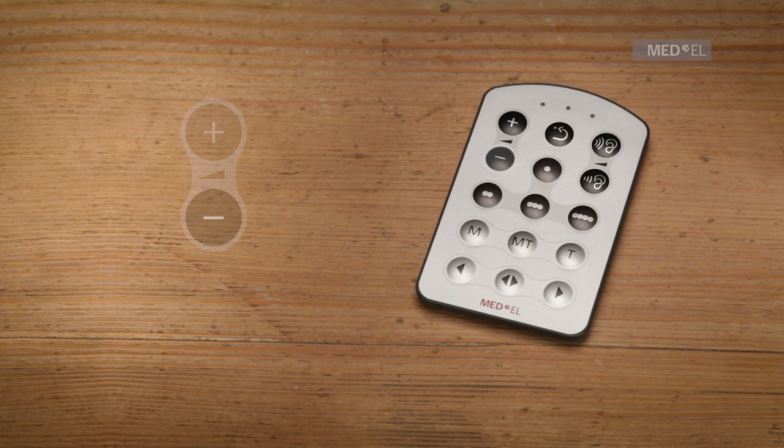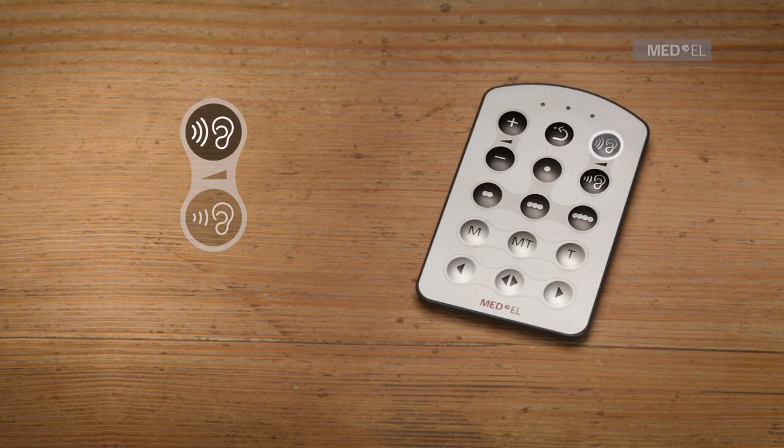To increase the sensitivity of your audio processor's microphone, press the upper sensitivity key. This will increase the range of the microphone, but may also increase levels of background noise.